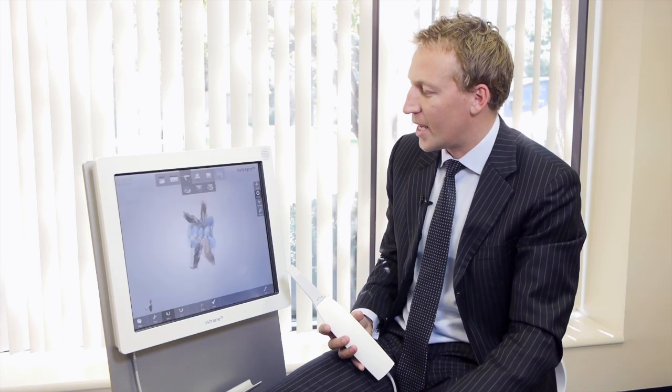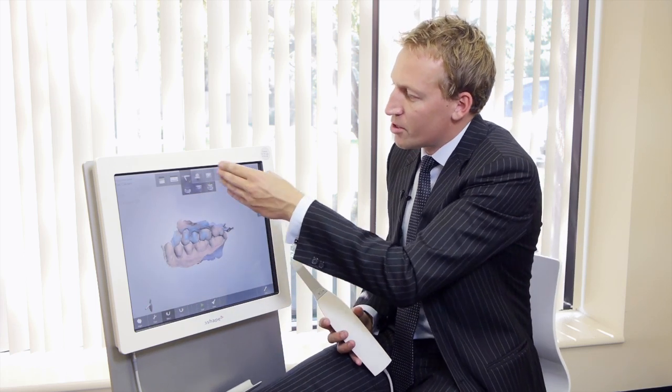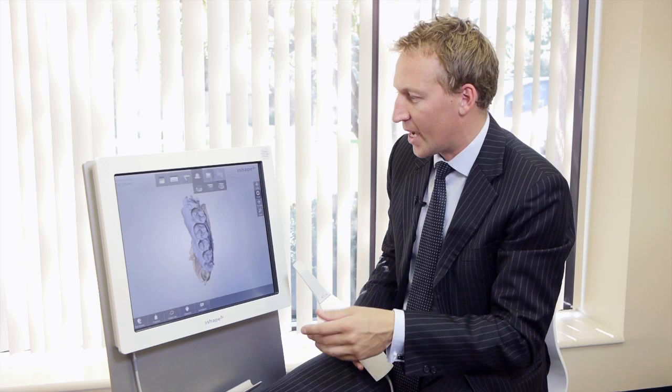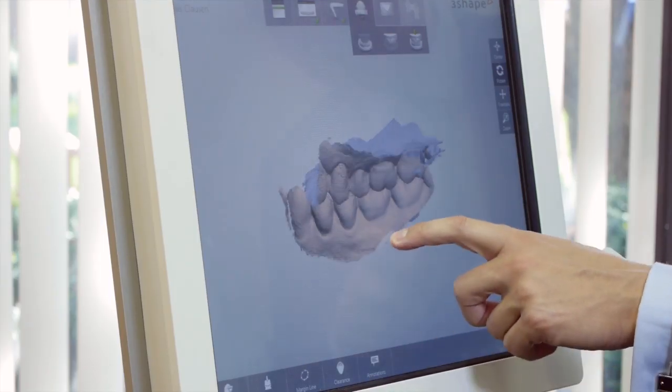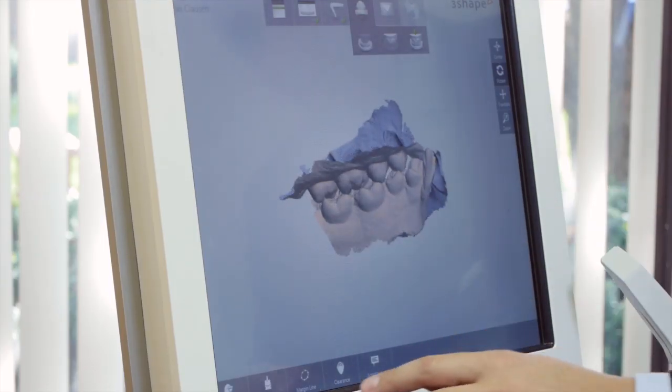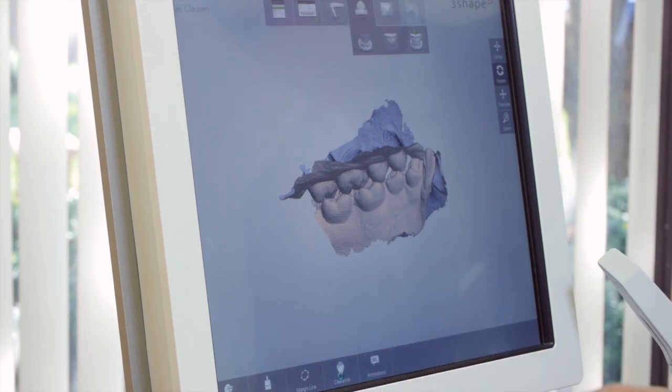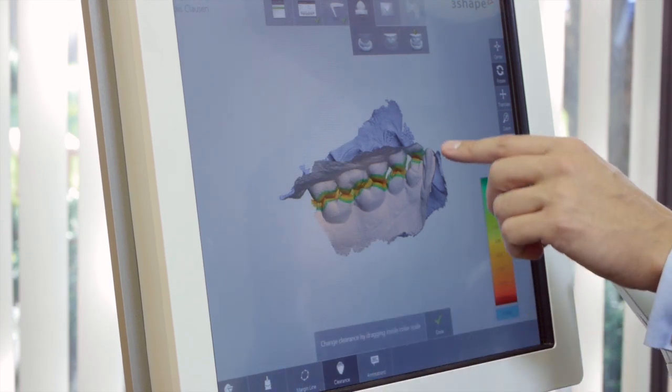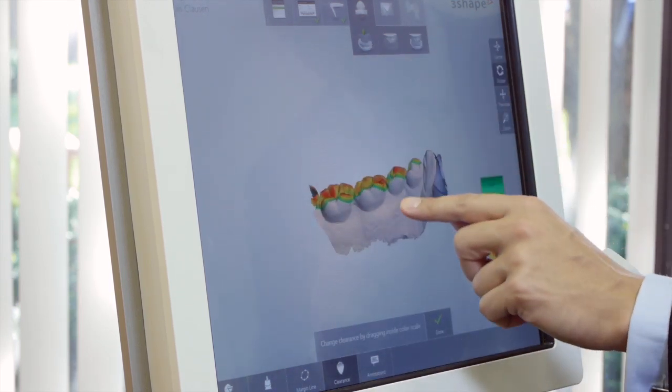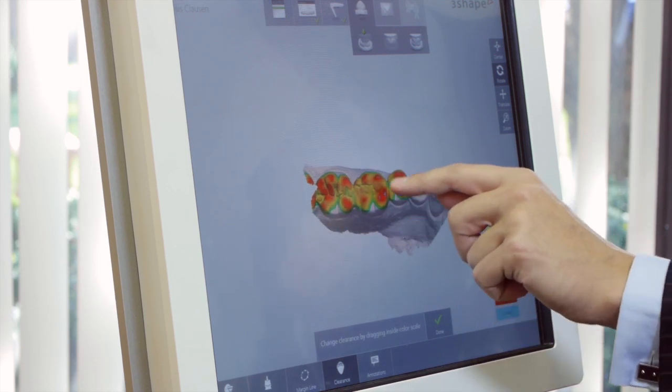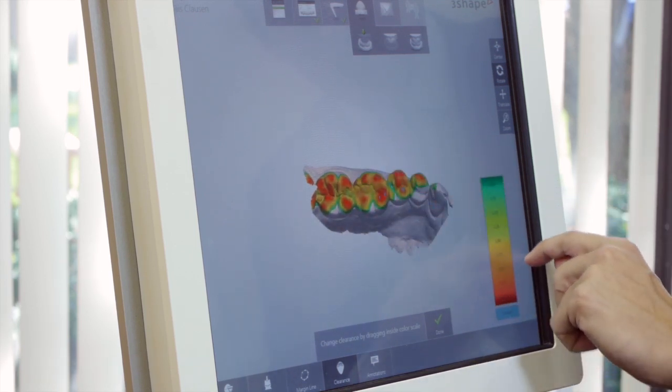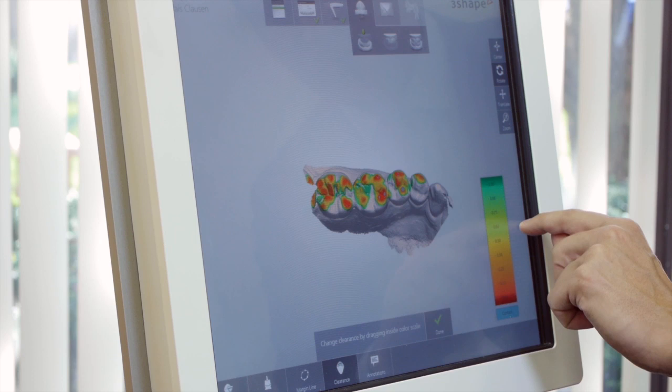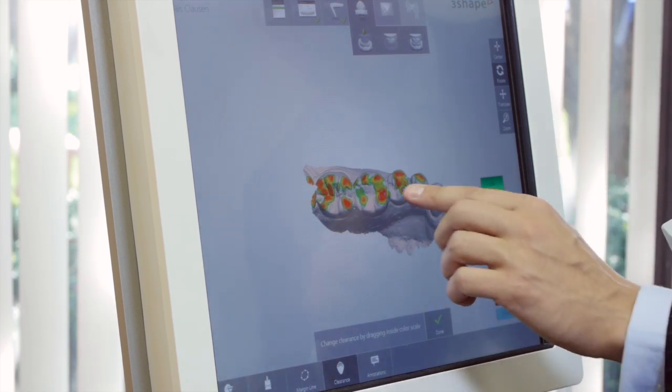Now there's a few tools that I want to show you where you can quickly analyze your scan. So obviously you can just move ahead and directly send it to the lab, but you can also do a quick analysis. Let's say you want to see the contact points of your scan, so then you can go ahead here and say clearance. You want to see the clearance from the prep, and you can turn on one jaw. So here you see the contacts and the clearance from the upper jaw, and you can even change the color map here to have different clearance picture.